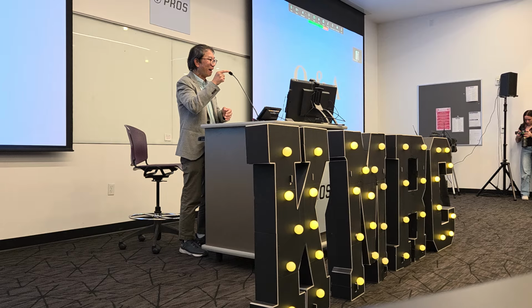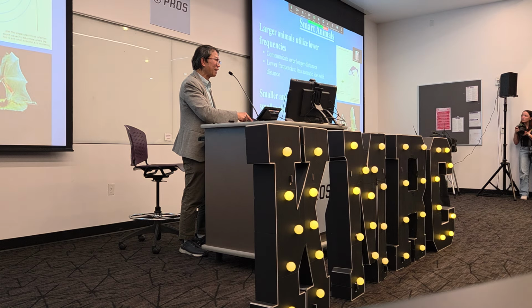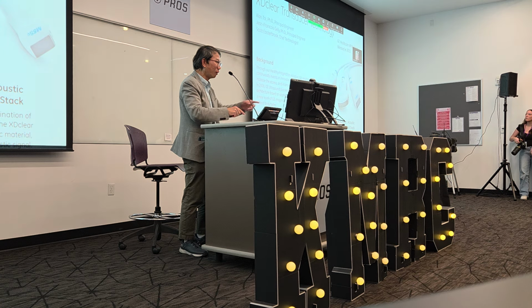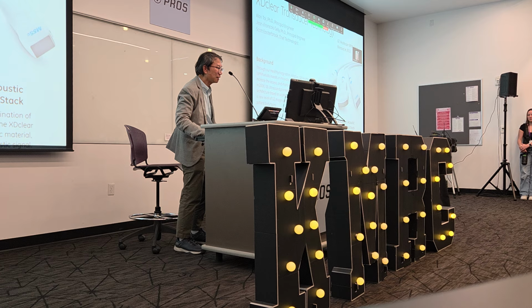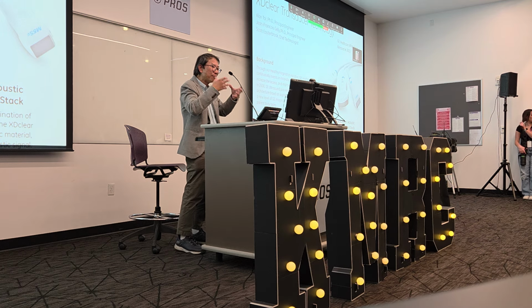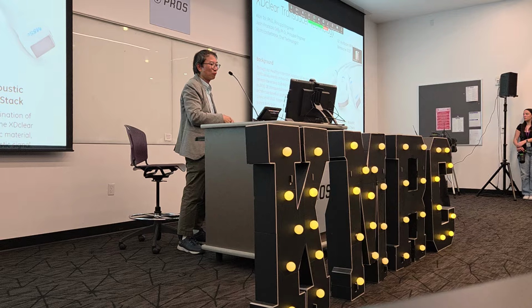So that's why the one I showed you, the transducer, was my contribution for the one in here. They need this imaging transducer to be very accurate to position the target, so that the bigger transducer can focus into the tumor. So in that case, the success rate is very high.